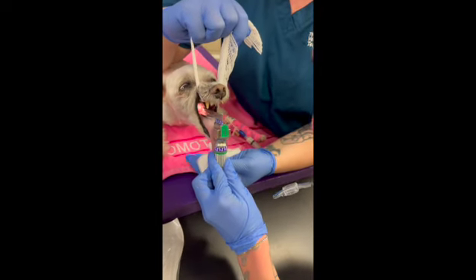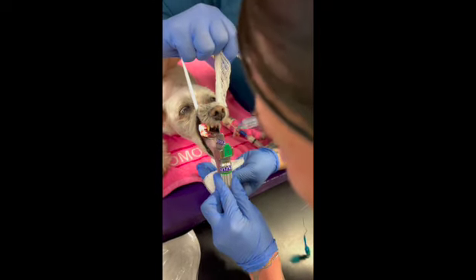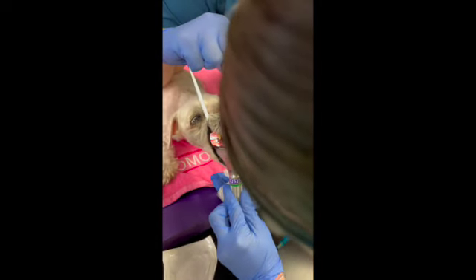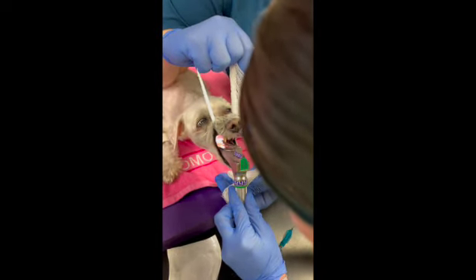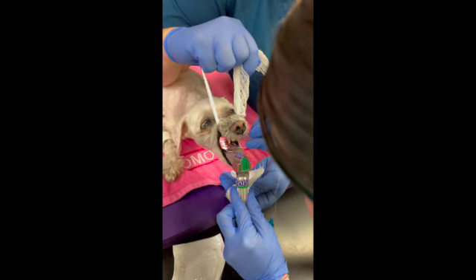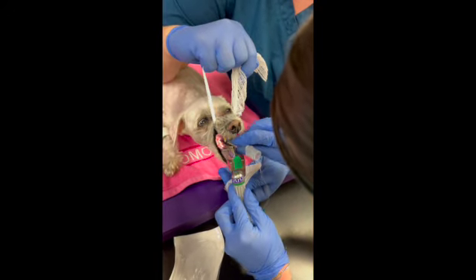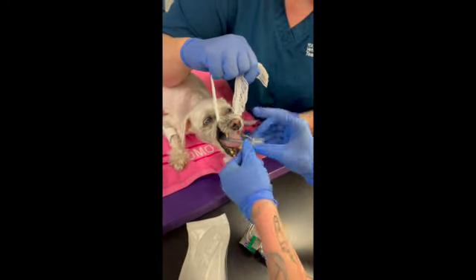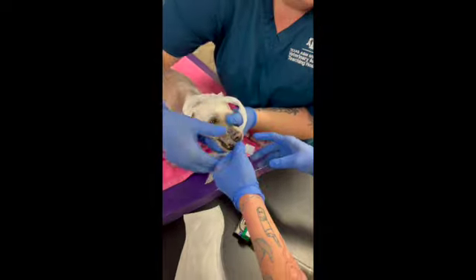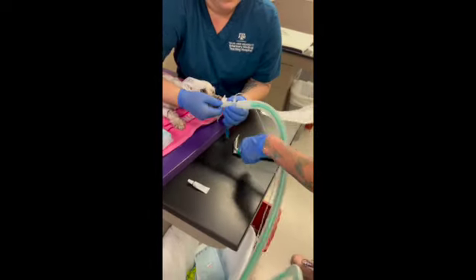Alright, and with the laryngoscope, you're just going to gently press on the base of the tongue to get the epiglottis to come down. If he continues to cough, I can give him more. Beautiful. And then I'll have us get him connected before we tie him in. Our student will go from here.